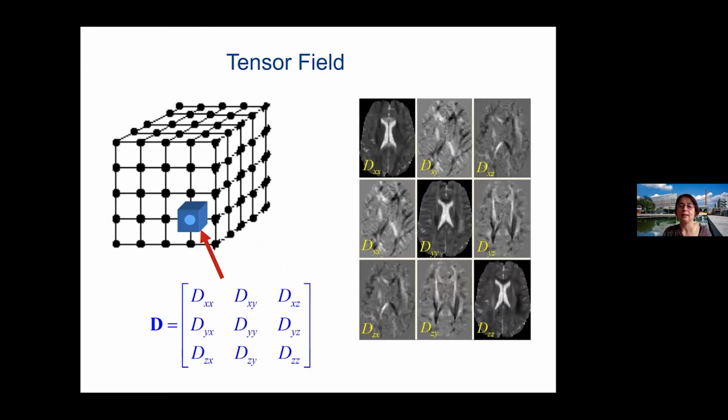So if we just take slices, like the images that come out of the scanner, I would look at this volume in slices, and for each component of this matrix, I just put it next to each other. There is very little information I can obtain from this kind of visualization, because it's very difficult to mentally reconstruct how the diffusion behaves by just looking at these images, which I'm showing here in the matrix. What you can see, for example, is that the ventricles in the diagonal are there, but it's very hard to get much more information than this.